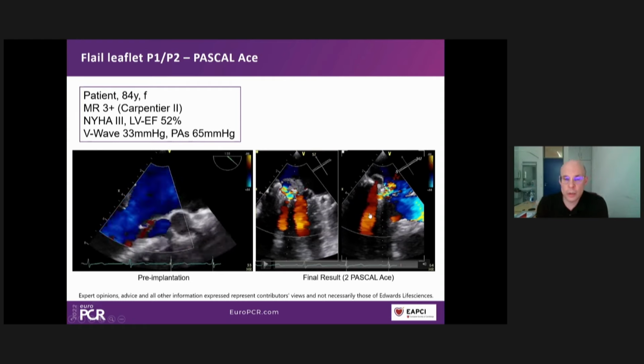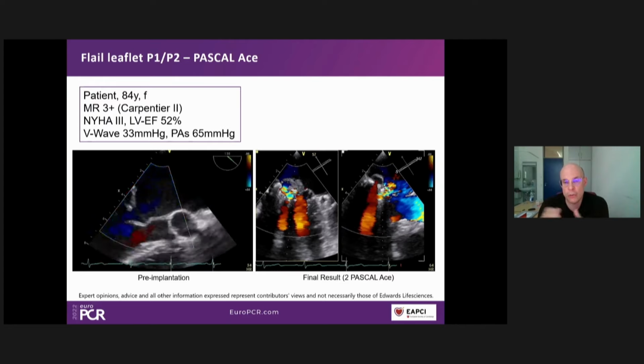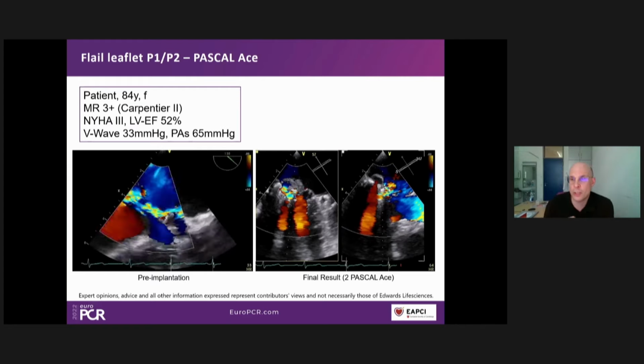So mixing devices is not a good idea. My experience is that when mixing Pascal and Pascal Ace, there is always a gap between the devices, so I would never recommend that. And for flail anatomy, we always use the Pascal Ace device. Thank you very much for your attention.